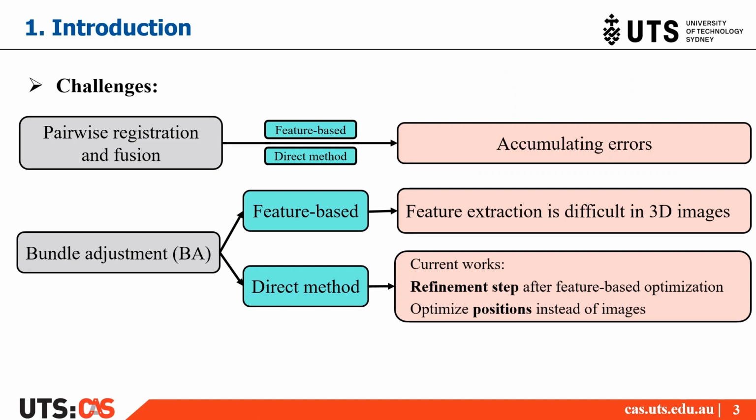Conventional methods separate image registration and fusion into two sequential steps. First, images which need to be fused are aligned in the same space. Secondly, these aligned images are fused together. Pairwise registration and fusion methods each time only estimate the transformation matrix between two images. Current 3D image registration and fusion methods for fusing more than two images are mostly derived from pairwise methods, which will incur accumulating errors inevitably.